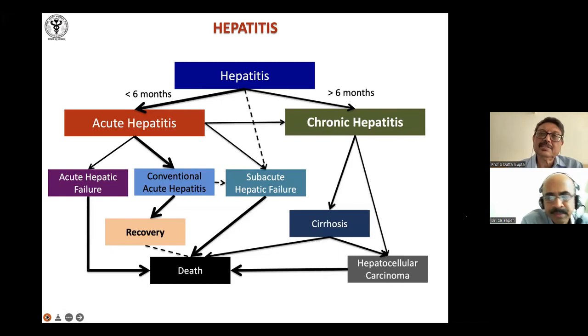The other thing is, it's not required now, especially. Traditionally, in the UK and elsewhere, they used to always try to screen for alpha-1 antitrypsin deficiency as one of the causes of chronic hepatitis. They didn't have that much of it. So they used to do it, and this is one easy way of detecting this.